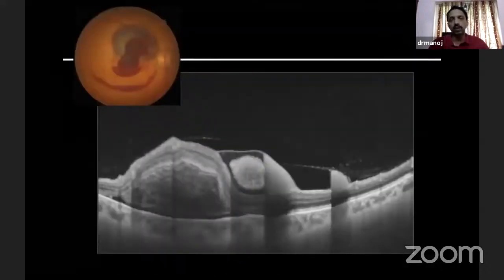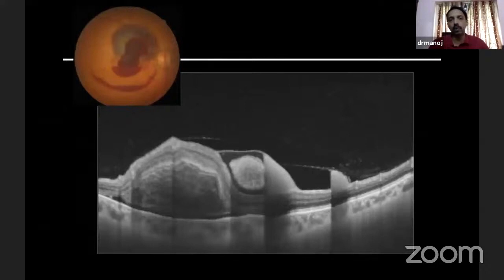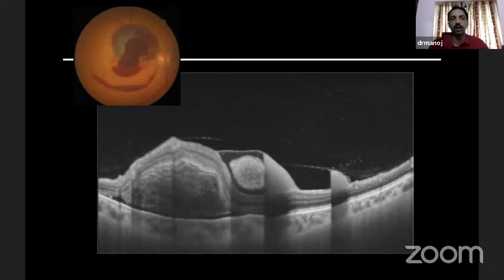In this image, you see there are different types of hemorrhages — pre-retinal hemorrhages, intra-retinal hemorrhages, and sub-retinal hemorrhages — and all these are causing changes in reflectivity, and therefore the underlying tissue is visualized in different forms.